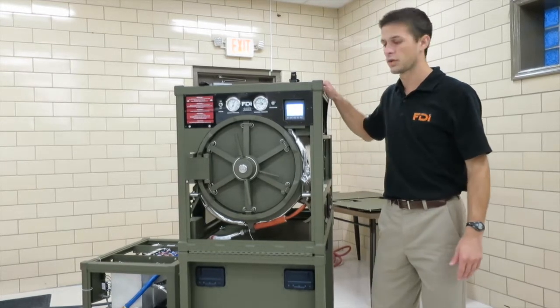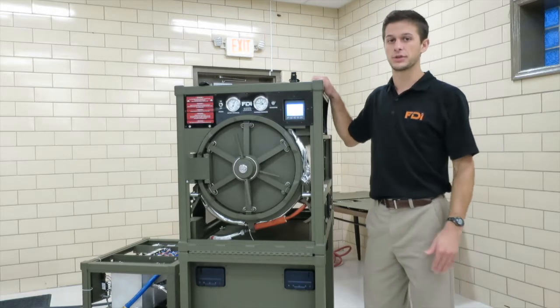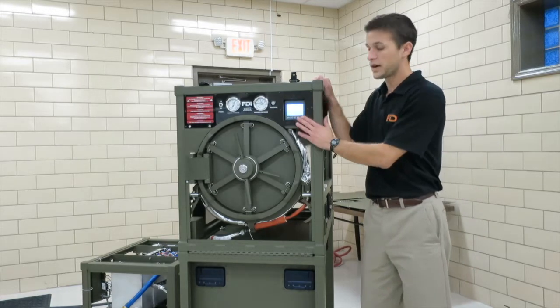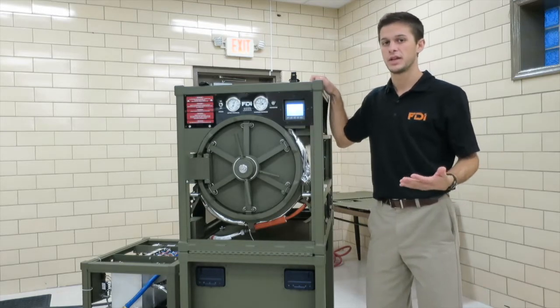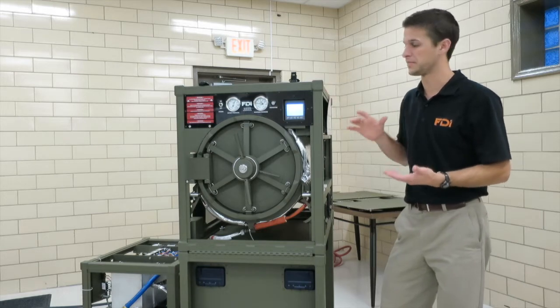I'm talking about the P2131 sterilizer, and in this video we're going to talk about how to troubleshoot a vacuum leak test. So if you've run a vacuum leak test on the sterilizer and you're not passing it, these are some of the things you can check to hopefully fix the problem.